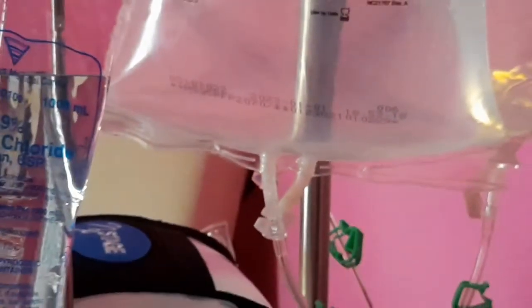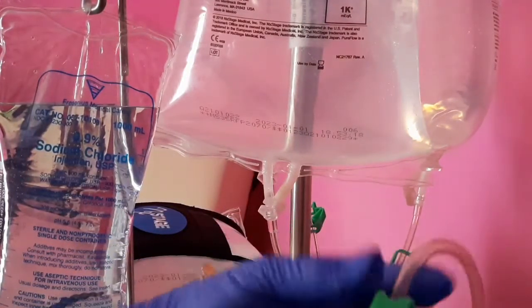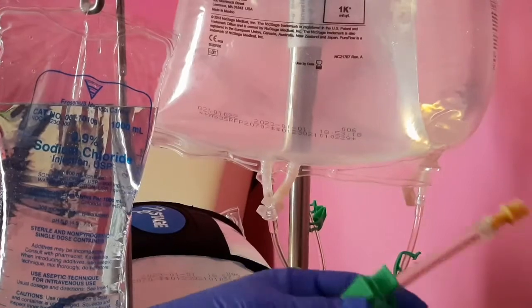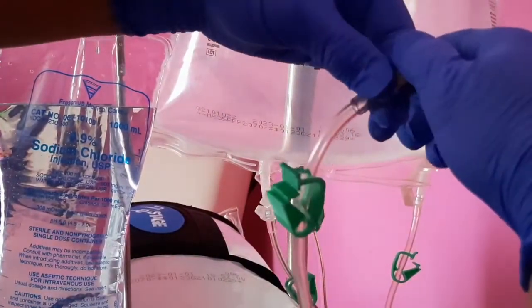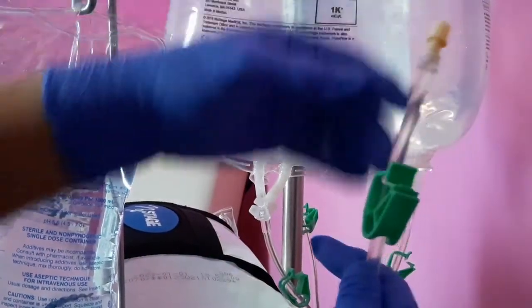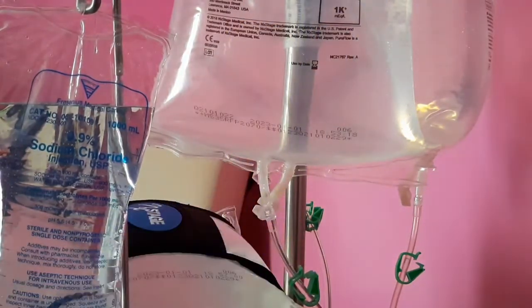But next, there's one more line. It's called prime. And that's this one, the one we're not using. Yeah, we've got to unclamp. Unclamp, okay? And then loosen the cap and let that water, that fluid, come up to the tip and then close it back up. And there, the water has run up through and we have primed it. We're not going to use it, so we're going to clamp it. So those are ready, okay?